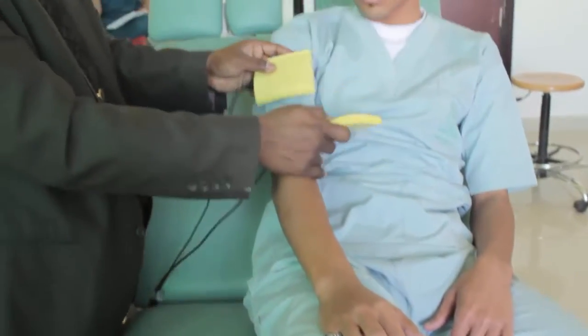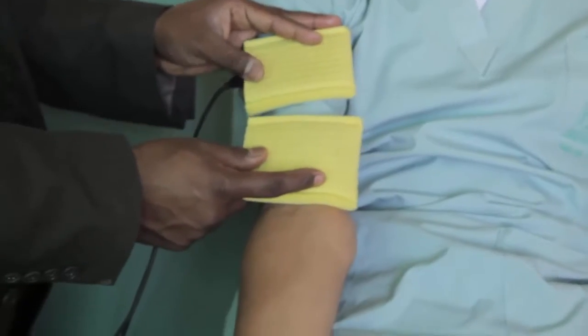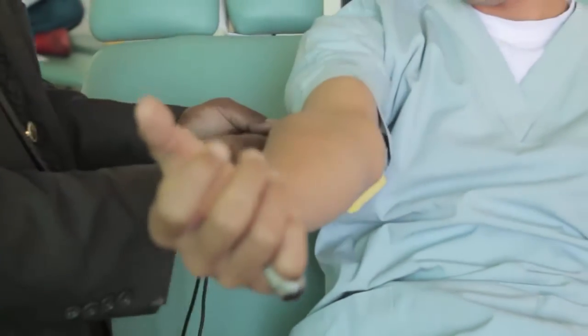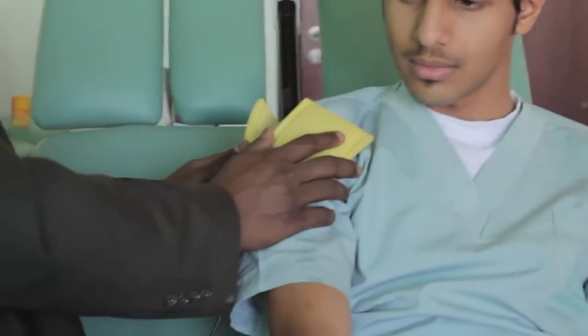Biceps and flexors of the forearm here, but the size of the electrode should be decreased a little. Triceps and extensors is here. Okay, and shoulder girdle muscles, like this, you can stimulate.